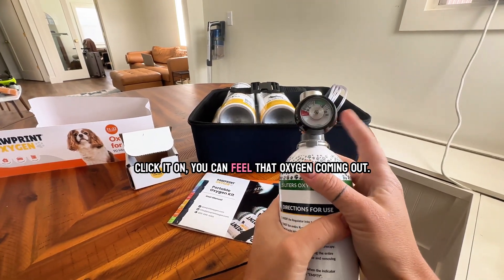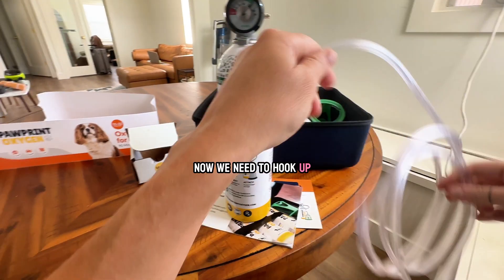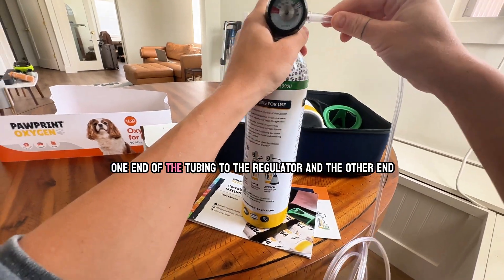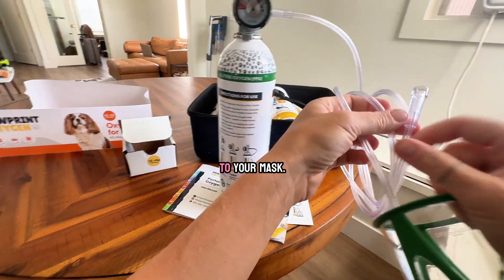Click it on. You can feel that oxygen coming out. Now we need to hook up one end of the tubing to the regulator and the other end to your mask.